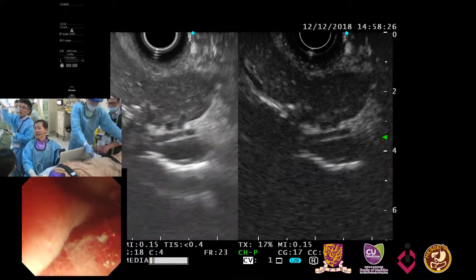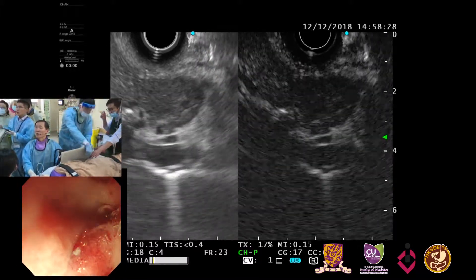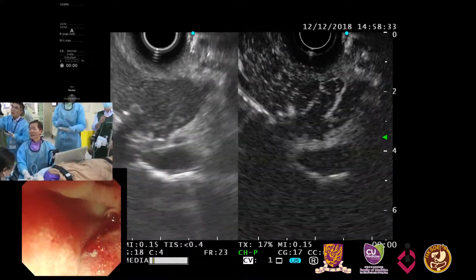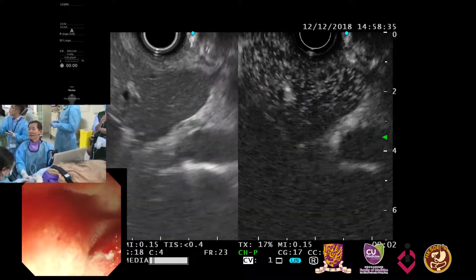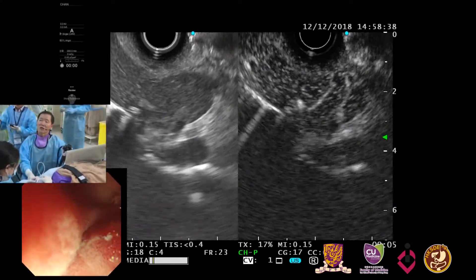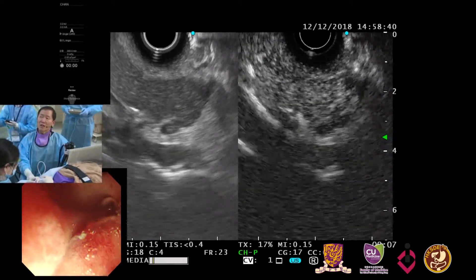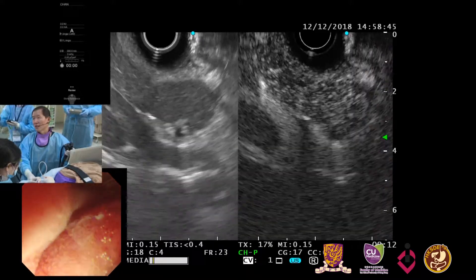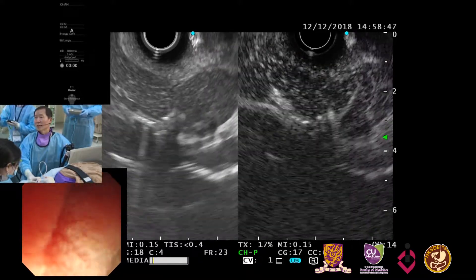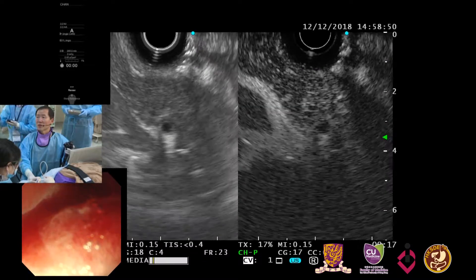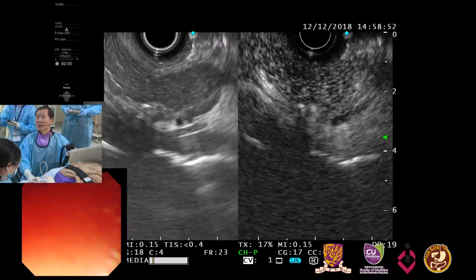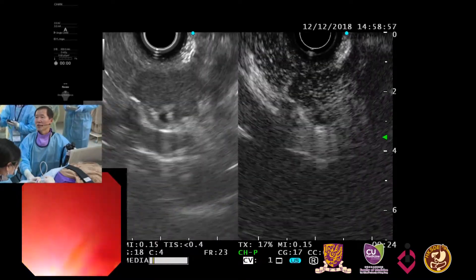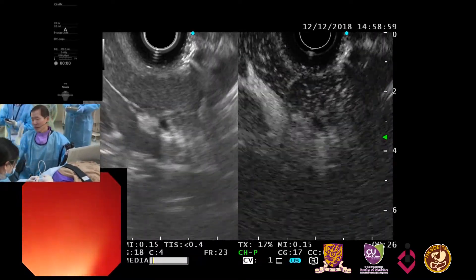Time after injection. We will see whether there is contrast enhancement from that area and the surrounding area. We are looking at the contrast initial arterial enhancement pattern. When you look at the arterial phase, everything looks the same, but I'm expecting more enhancement in the inflammatory region. If it is an inflammatory region, it will show more clear, strong enhancement. The important thing is the Kupffer cell phase.